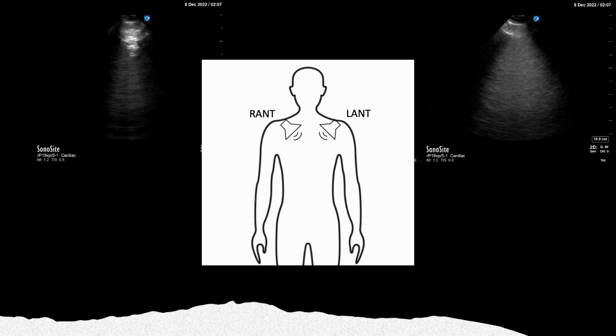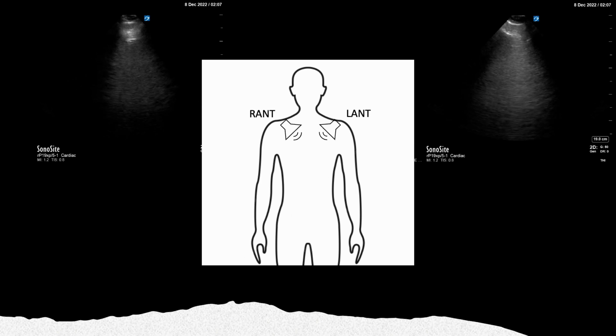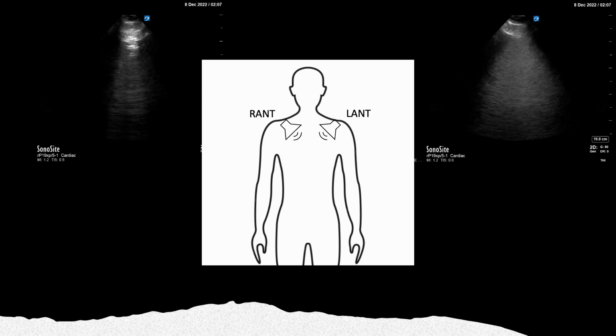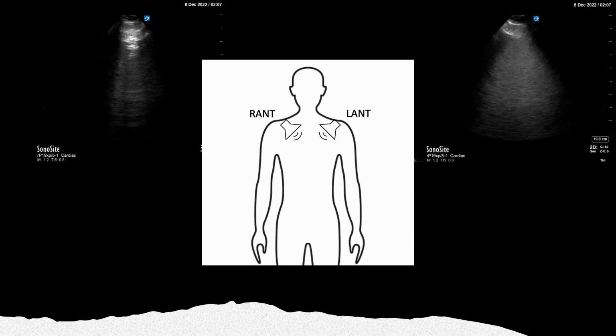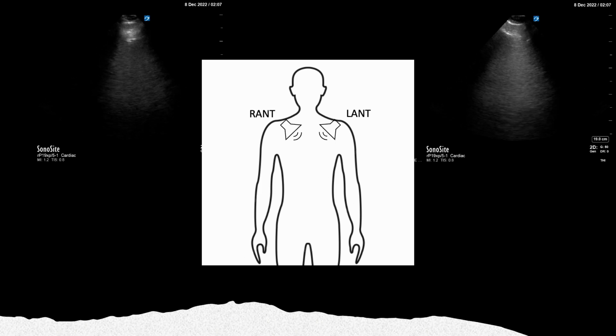I can see that there are what are called B lines coming down. I'm looking between one rib space here. It's normal to have up to 3 B lines, and those B lines are those sort of shadowy projections going down. And in this patient, they're almost uncountable. When they take a breath in and you try and pause it, you're probably going to see 3 plus, 4, 5 maybe, and they look quite homogeneous and it looks like a snowy kind of picture.